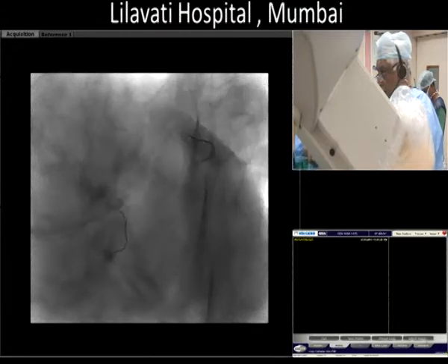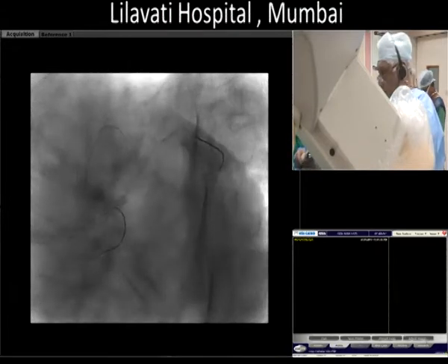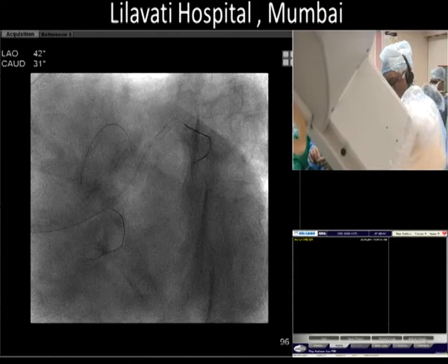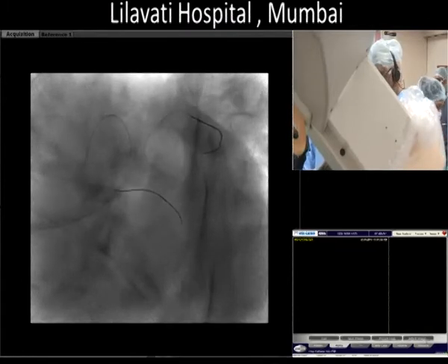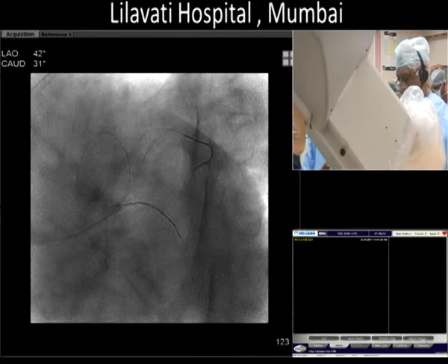That's sometimes the issue, that if you go outside the stent, you have edge injuries that you don't realize. He's taking a short stent, I will make sure that I hit all lengths, but the main issue is that midpoint, which is not expanded, where the dissection was. You need to make sure you take your time and go up. You might have to go up twice, but as long as you get expansion, it's key.